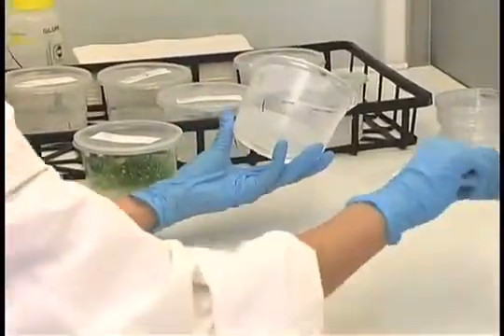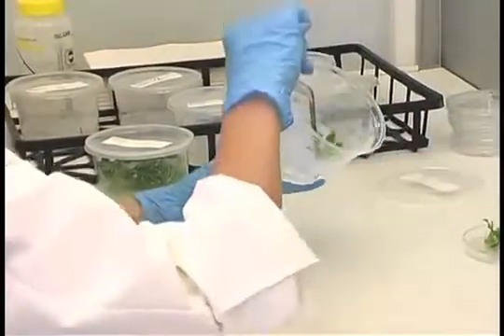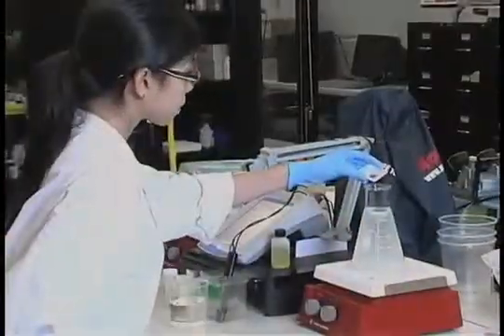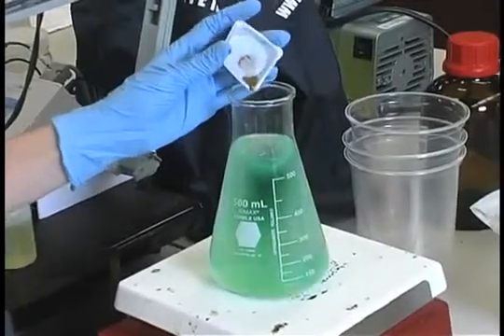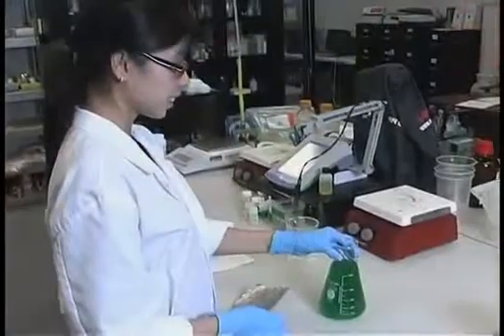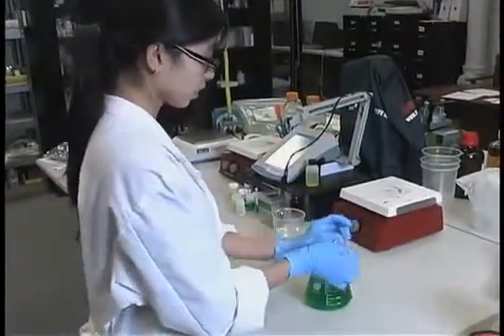Allow the medium to cool prior to use. This will usually take 30 minutes to two hours to completely cool and for the gelling agent to properly solidify. You can also use powdered food color to color code your medium for easy identification. Red, green, blue, and yellow colors are sold individually or as a sample package under product M5856.